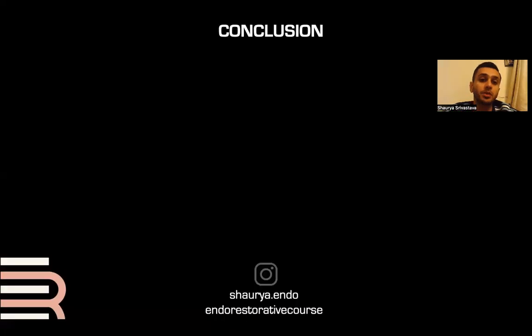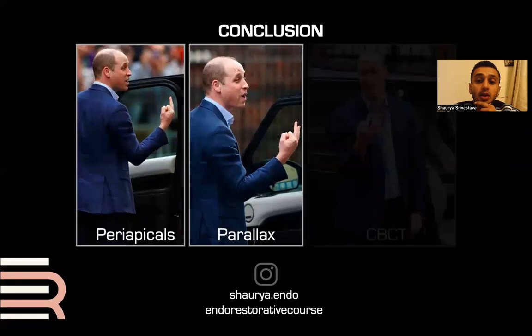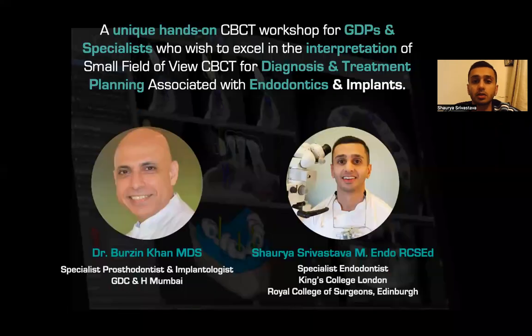All right. So that brings me to the end of this webinar. Thank you guys for signing in. So that's my conclusion, and that's a periapical, that's a parallax, that is your CBCT. You get a holistic approach. You see much more. It's a three-dimensional view of a three-dimensional object, and the evidence all suggests so, as well as all the cases I've shown you, that CBCTs are something that should be used routinely in endodontics.